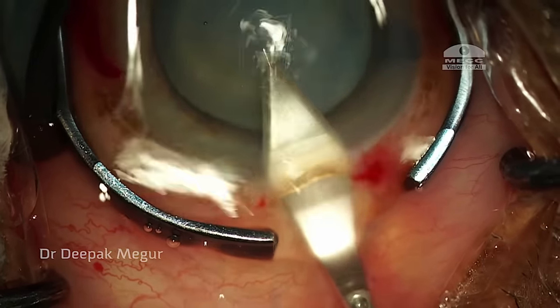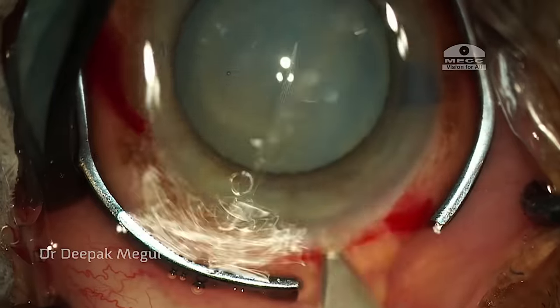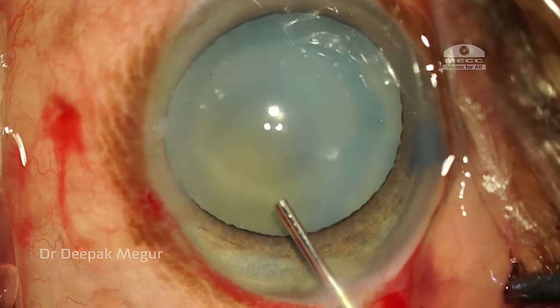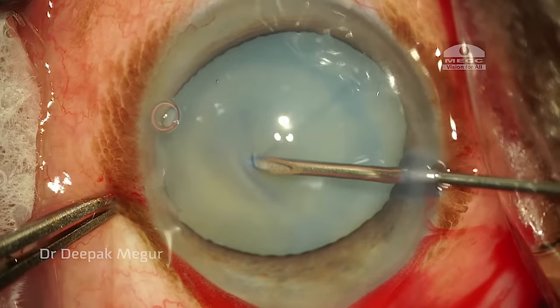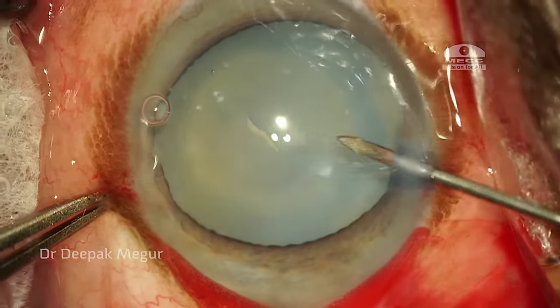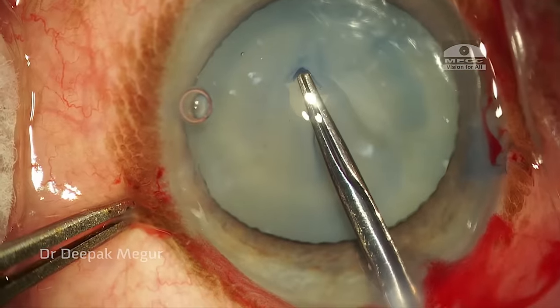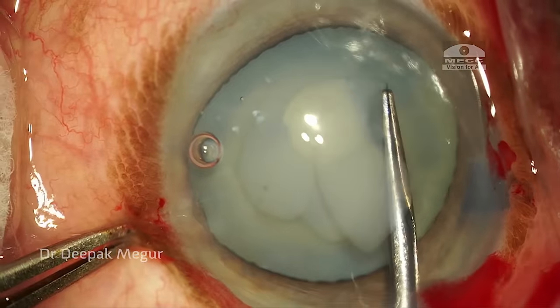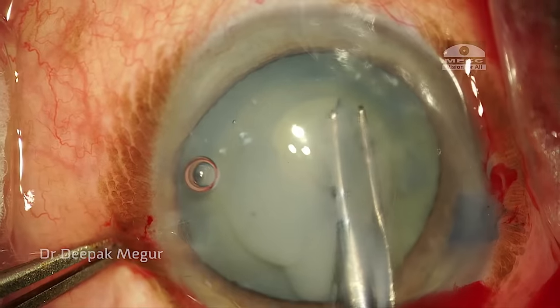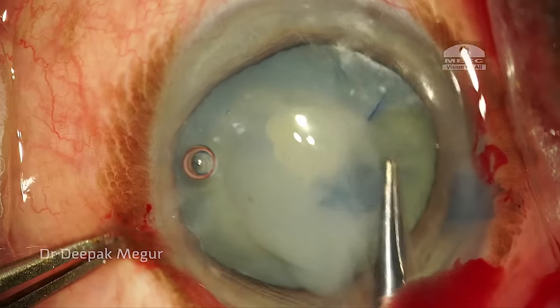This is a temporal 2.8 millimeter incision. I begin my capsulorhexis. The wrinkling of the anterior capsule clearly suggests how weak the zonules are, so forceps is the best bet in such a situation. I grasp the anterior capsule and carefully proceed, but as anticipated, as soon as I reach the danger zone, the capsular bag is moving and the capsule refuses to tear.